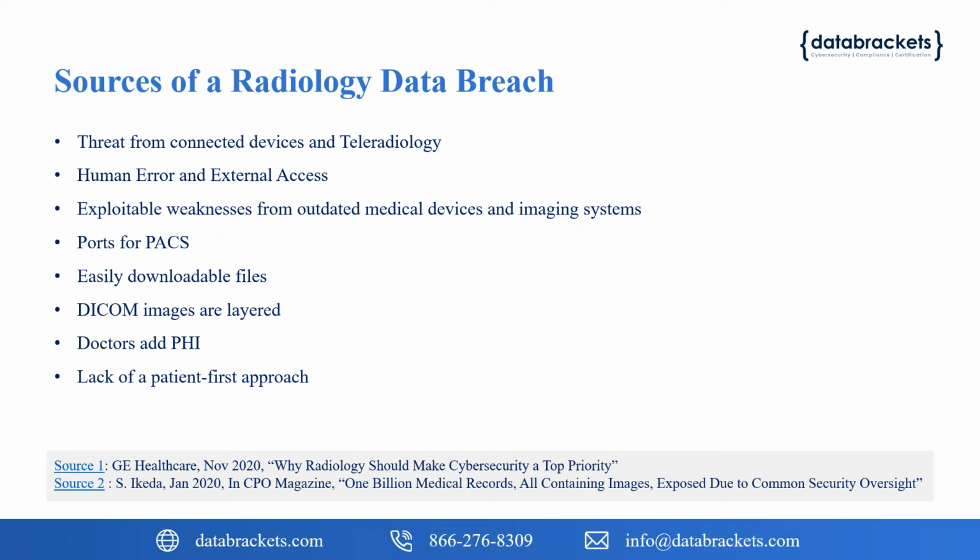And then the fourth thing, if you see the ports for the PACS, they are using pretty much the standard, publicized port numbers for the server. If I have a scanner and a list of IP addresses, that's how the servers are recognized. Just like you and I have a name to represent us, the servers are represented by some kind of IP address.